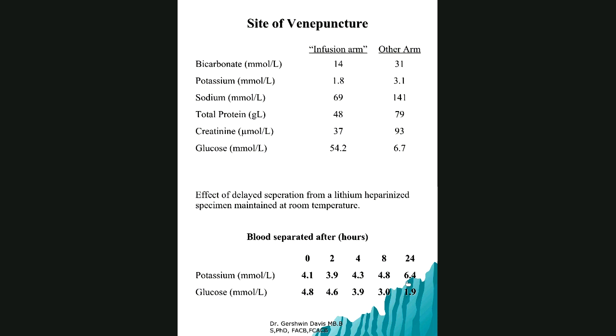Somebody has asked, does potassium get elevated due to chelation when put in the EDTA tube? Well, remember that's one of the possibilities of pre-analytical error: wrong tube. If you put it in a potassium EDTA tube, it will be elevated immediately. Nothing about delayed separation here is different. So you need to put the sample in the correct tube. That's a very important point again.